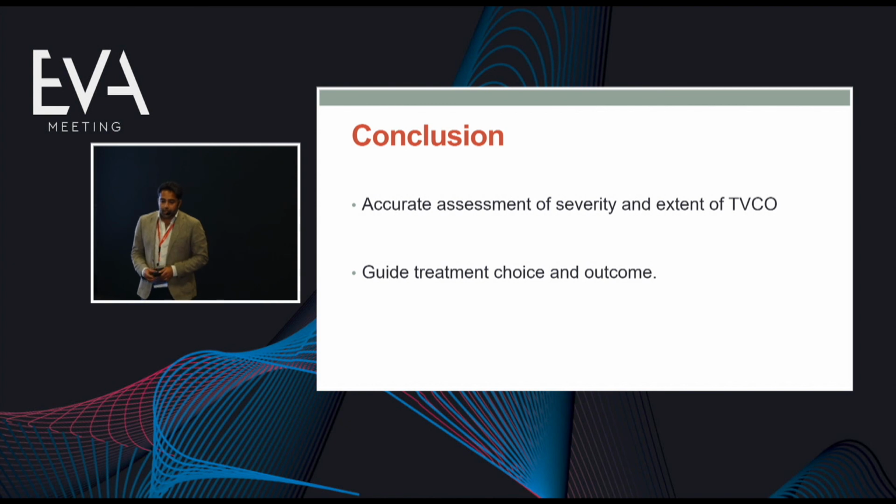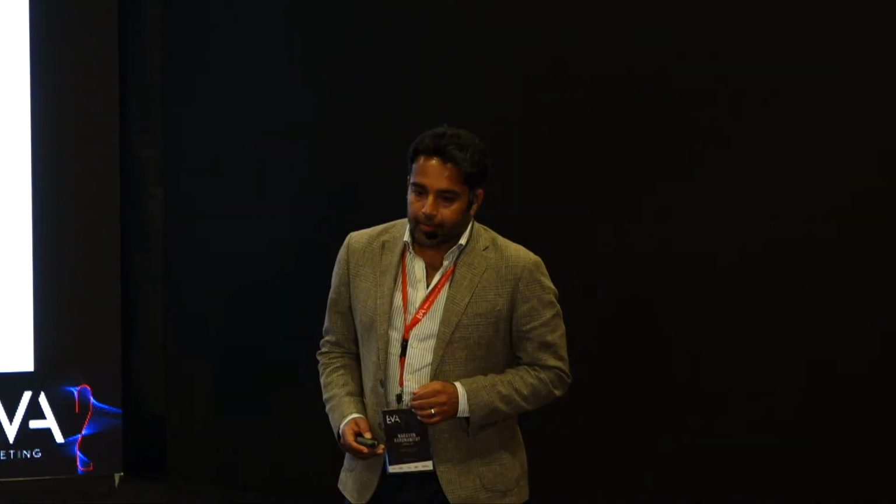So in conclusion, I'd like to say that intravascular ultrasound allows for accurate assessment of the severity and extent of the disease, and importantly gives us a good guide on treatment outcome. Thank you very much.